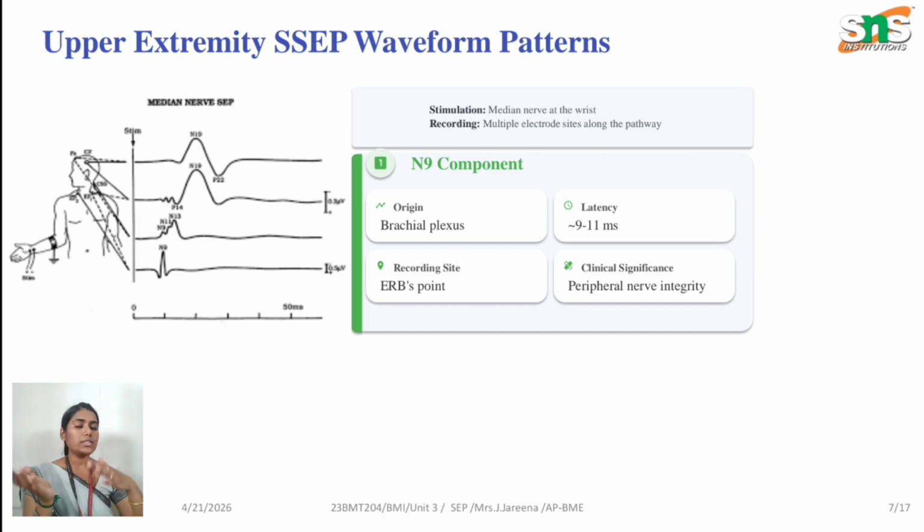As we discussed already in visually evoked potential, here also we get the waveform in different components, different negative peaks and positive peaks at different times. Here the latencies matter, because latency is nothing but the time taken for the stimulus to give the response. That is the latency, a measurement of time. If you see any delay in this latency, we already have standard values.